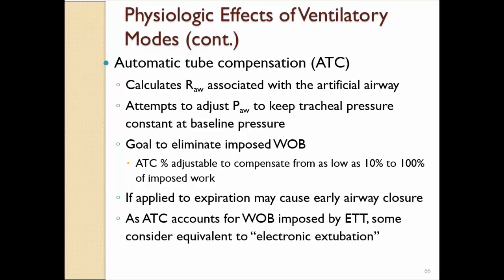If you have both of them engaged at the same time, it might give you a false picture of the patient's capabilities. So you need to go and look and make sure this is either turned off or turned on, whichever one you're going to use. Make sure you only have one of them running at a time.